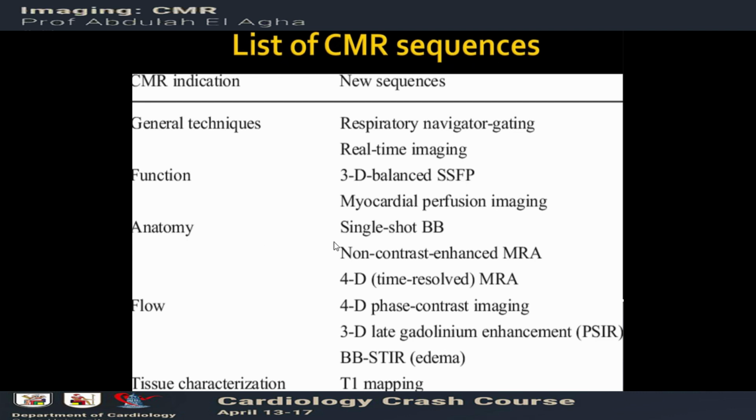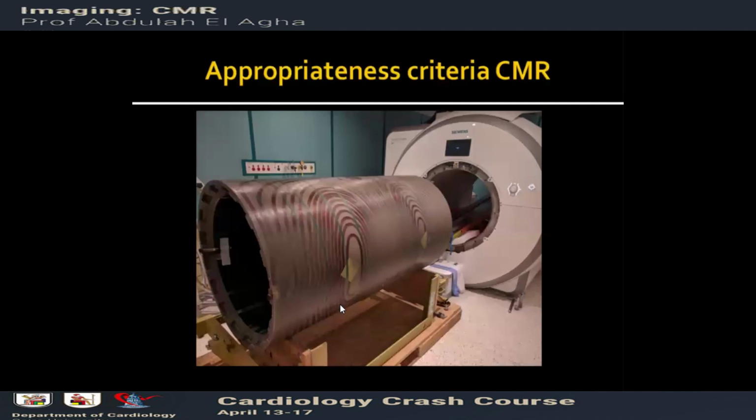Of course I can look at the anatomy, different sequences. I can do tissue characterization. I can inject gadolinium and then wait and do late gadolinium enhancement. هيديني باترنز مختلف برضو للتايب بتاع السكار أو الفايبروز زي ما هنشوف.